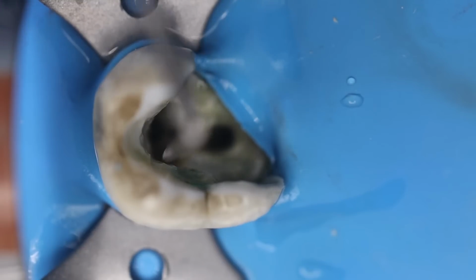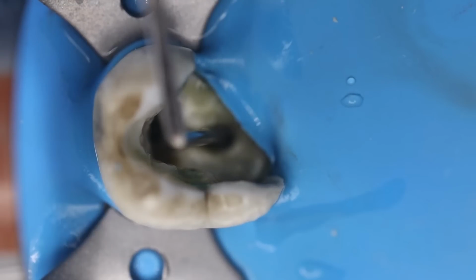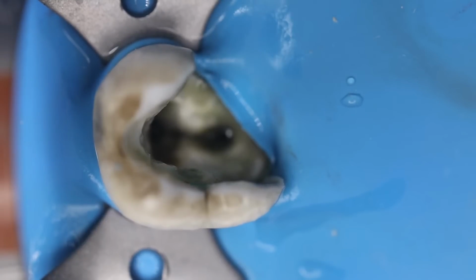So this is the access that you obtain after doing the access opening in a mandibular molar, and this is the second mandibular molar, where you get a distal canal and 2 mesial canals.